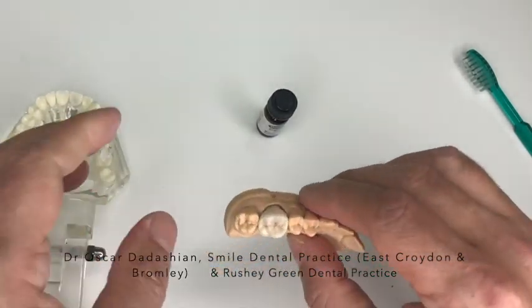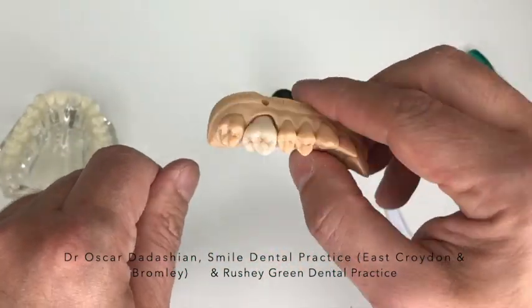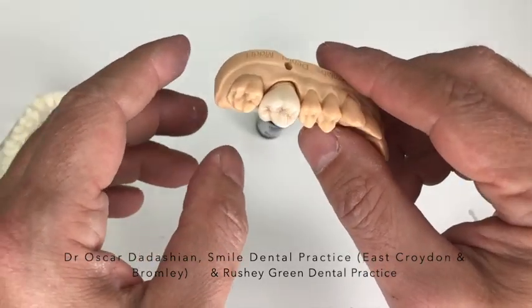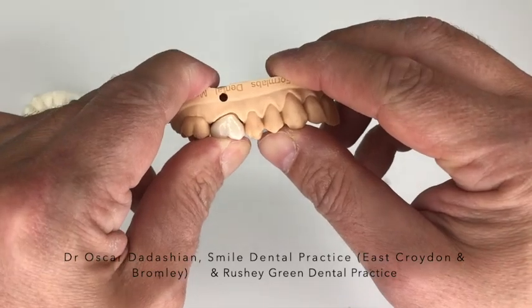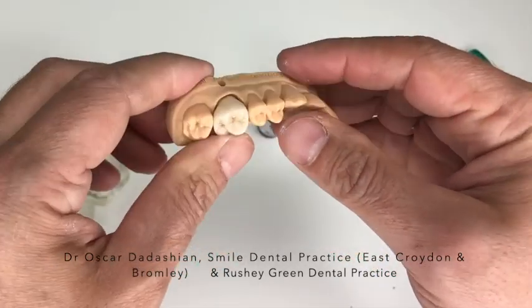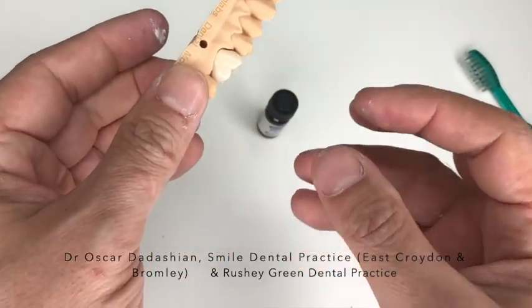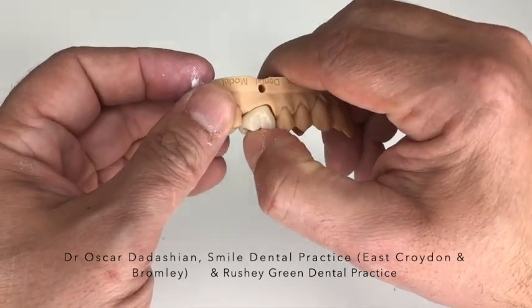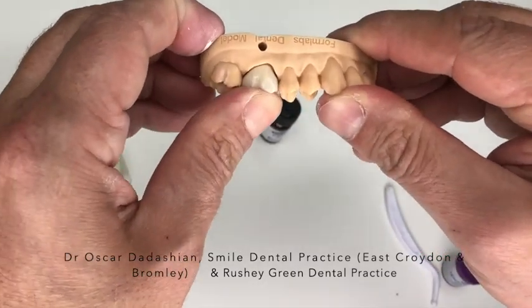And then I place it on the tooth. When you place it on the tooth, it's going to feel raised. It hasn't gone in because the material is there. This material is going to function as a space filler. So then you have to gently press it in, make sure it goes in place. And that's the time you then start biting on it and make sure that it goes in fully. Obviously don't bite too hard to break your tooth, but definitely bite on it.